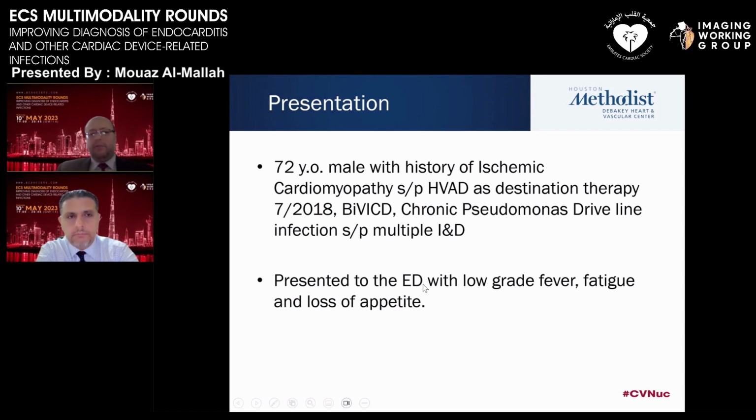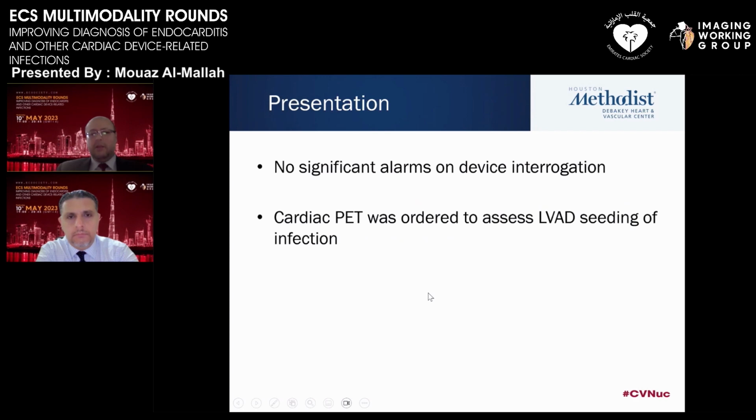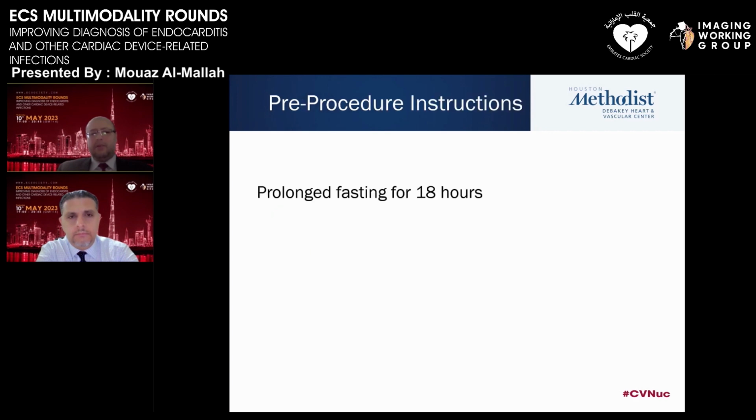Obviously the source of fever may be from somewhere else, but this could be getting worse. So there are no significant alarms on the device interrogation, and this patient had both PET and CT, so I selected this case to show you that.